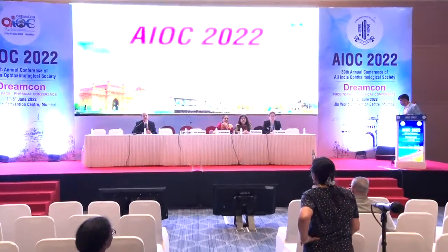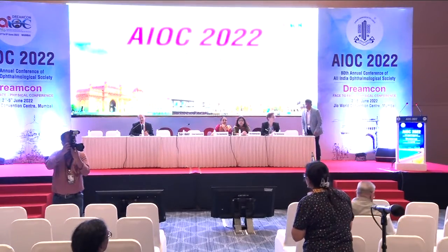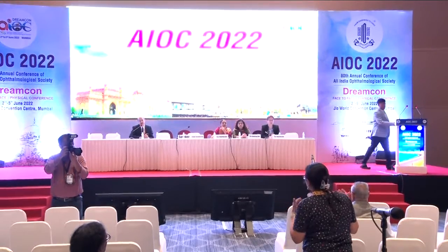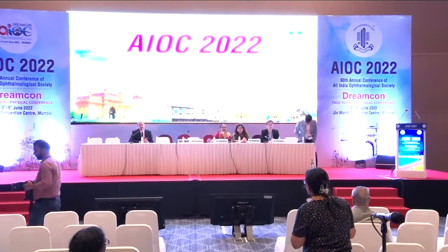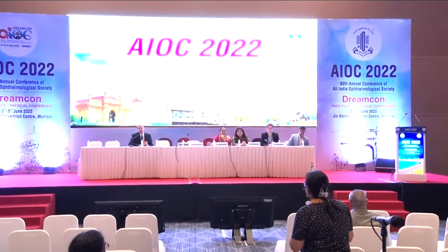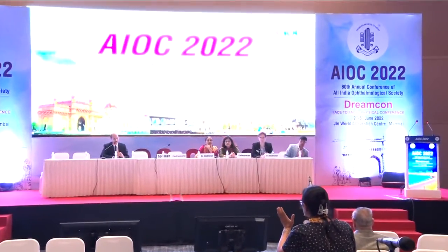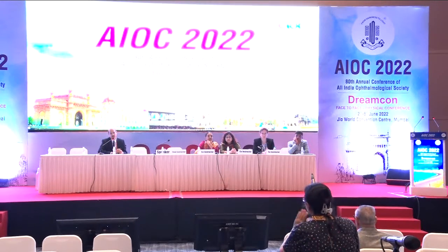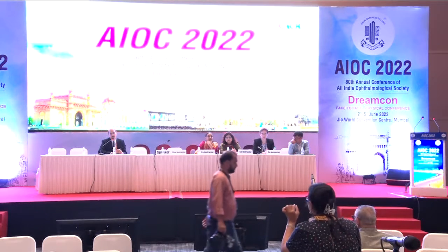Actually, the question is why 24-2C? Definitely we would like to not see the moderate or advanced glaucoma. We just want to find out the central visual defects in early glaucoma. Now, the 24-2C and the cluster, if you just compare the global indices, both 24-2 and 24-2C, the MD, VFI, and PSD mode are the same. So the question is cluster.